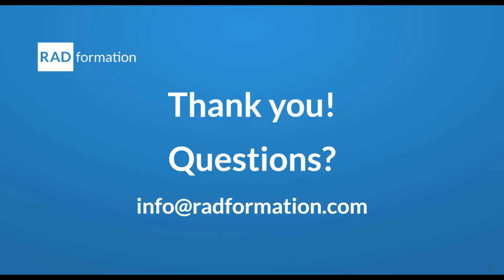Yeah, it's a great question. So there's a couple options on the Electron front. We do have base data that we have built in anytime you install the software on as like an Eclipse CAP machine, and it really is just Eclipse base data for like a 21 series machine. So that data you can just kind of utilize out of the box as you sort of get familiar with ClearCalc. The other option is we have the ability to synchronize data with Eclipse. So we have this button that you can click in admin and just point us to where your beam data folder is on the Eclipse side.